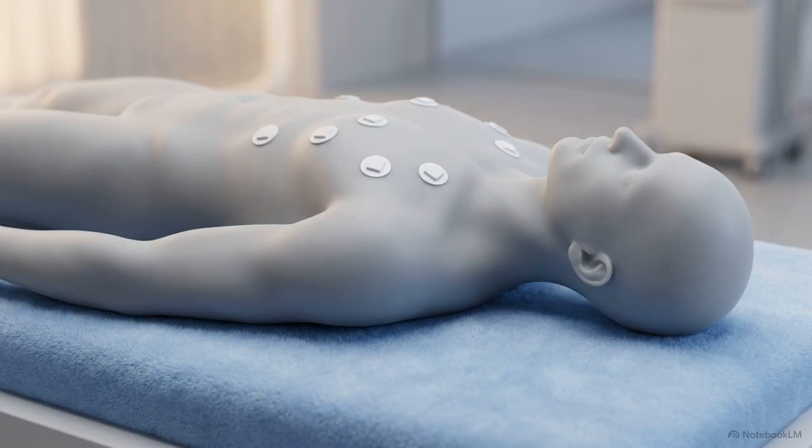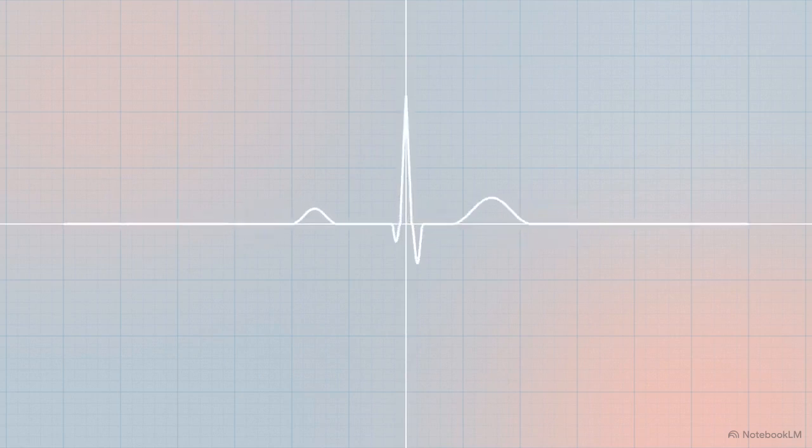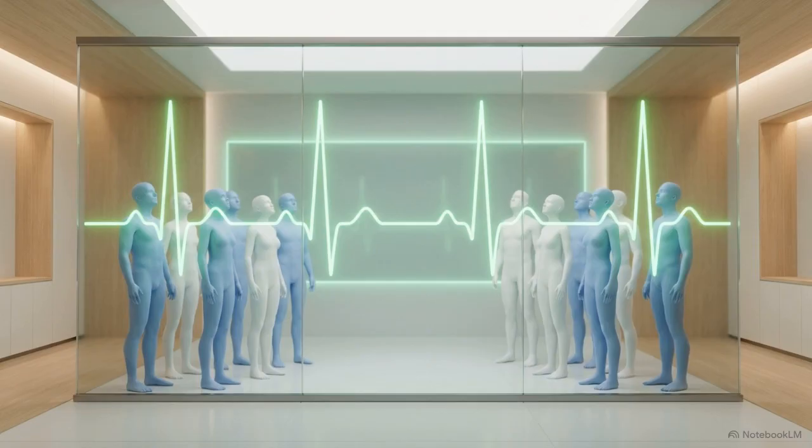The ECG provides high-resolution data on heart function through a simple, non-invasive procedure. By translating fundamental physics into actionable clinical data, the ECG remains the primary standard for patient safety, drug evaluation, and clinical decision-making.